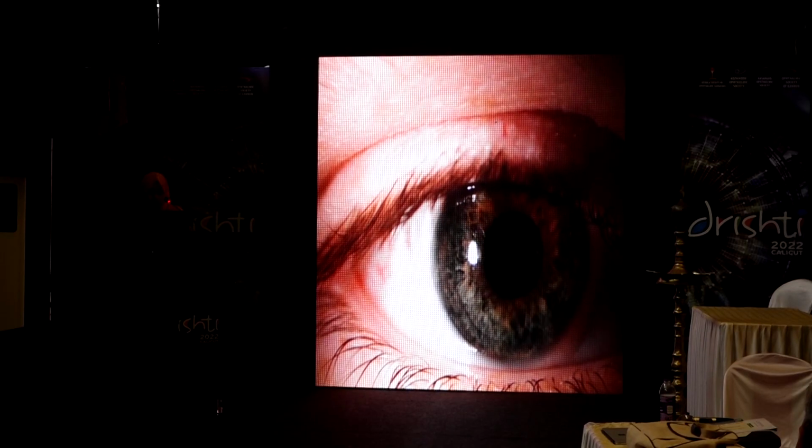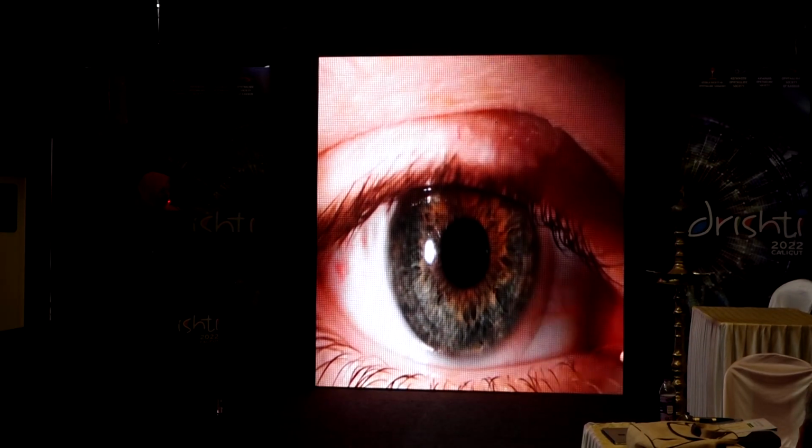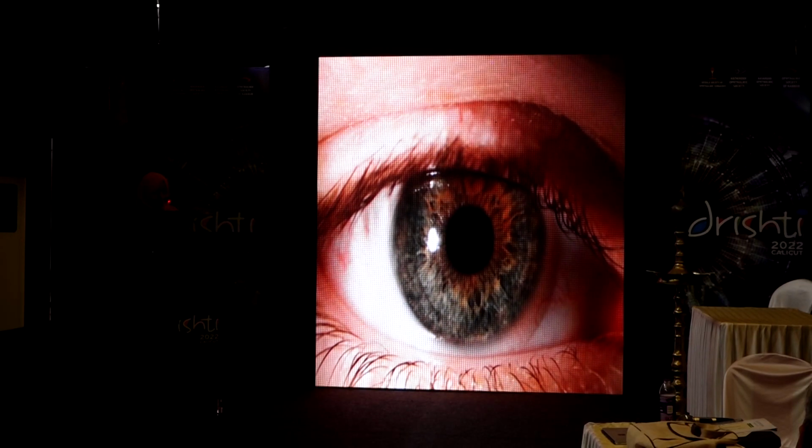So there is a small video showing the soft contact lens fitting, where the centration of the lens coverage.